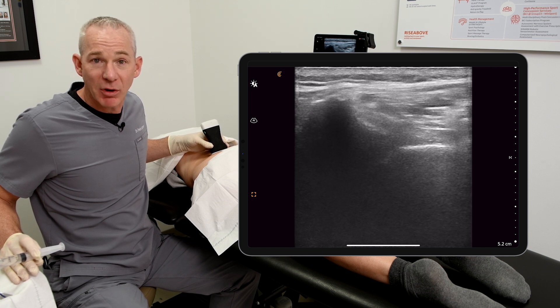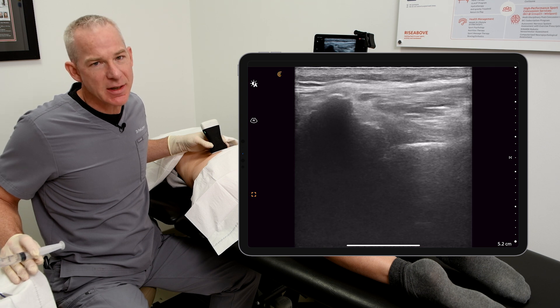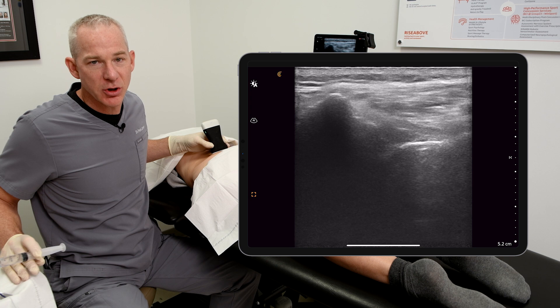With PRP, we're trying to get into the ligaments surrounding the joint, and also to get some into the joint. So this is not a traditional interventional radiology approach to an SI joint injection.